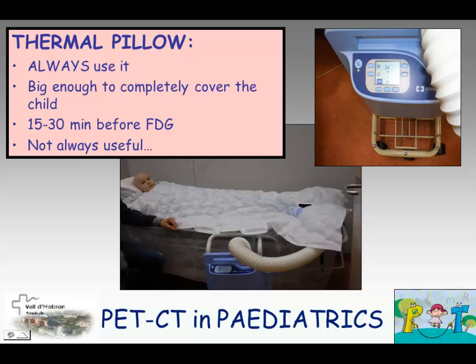This is the thermal pillow that we use. It is the same that they use in the post-surgery areas. We always use it, and it's big enough to completely cover the child. And we usually use it 15 minutes, but if necessary, 30 minutes before the FDG injection. But it's not always useful, and sometimes, for example, now at the beginning of the winter, we have brown fat uptakes.